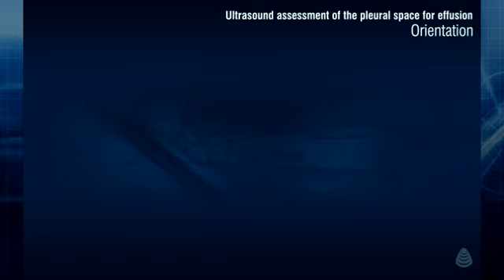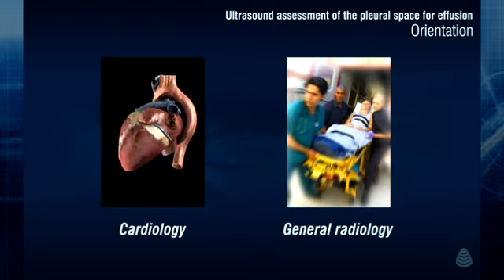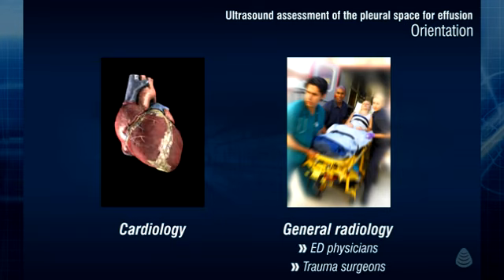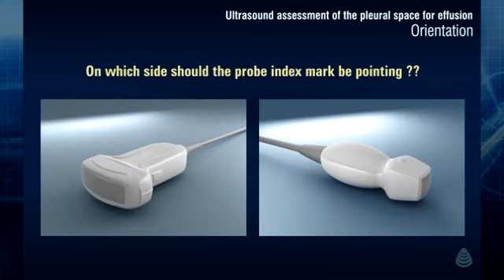Physicians performing chest ultrasound will often have some background in ultrasound from either the cardiology perspective or from the general radiology perspective, like the emergency department physicians and trauma surgeons performing the FAST exam. So, on which side should the probe index mark be pointing?